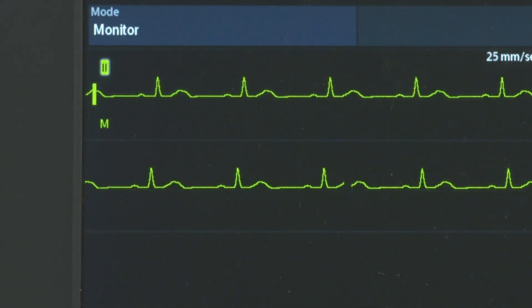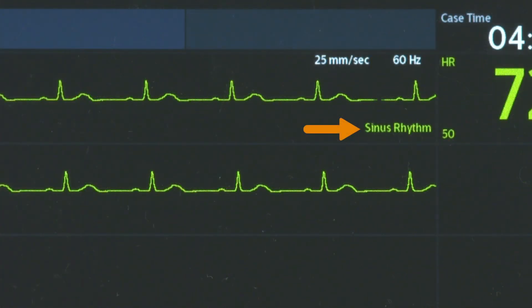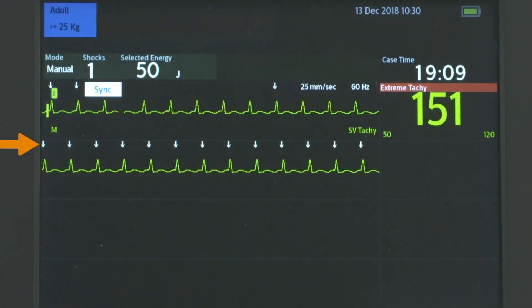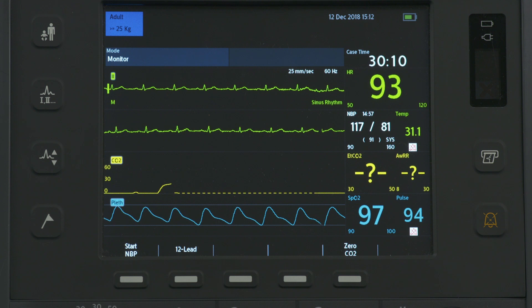Wave Sector 1 also contains the ECG calibration bar, the auto-gain indicator, rhythm label, ECG filter setting, and R-wave arrows. Wave Sectors 2, 3, and 4 are automatically populated when parameter cables are connected.